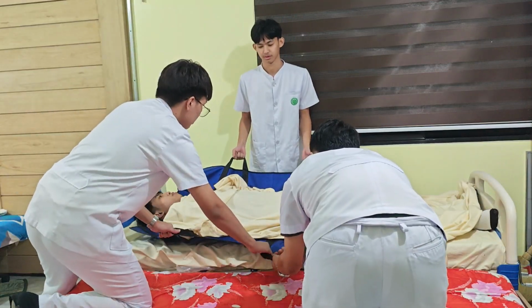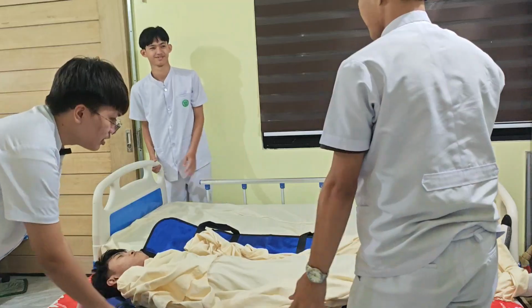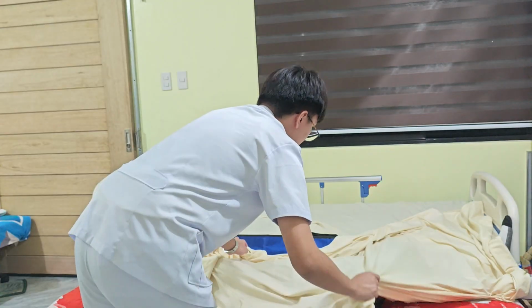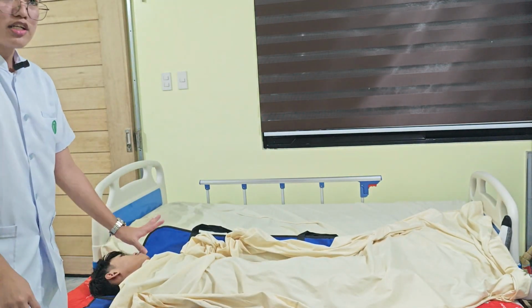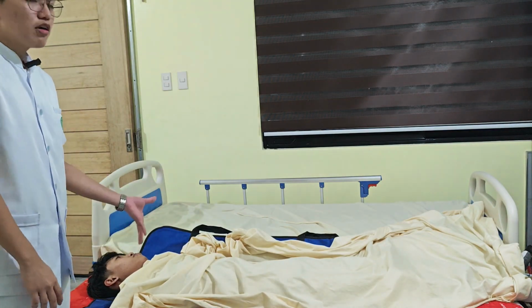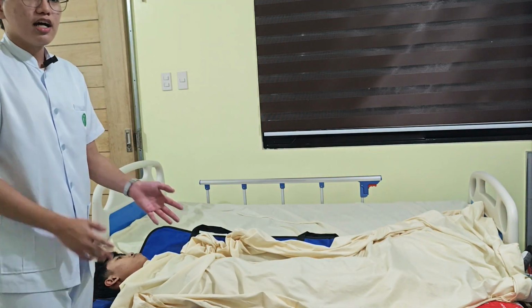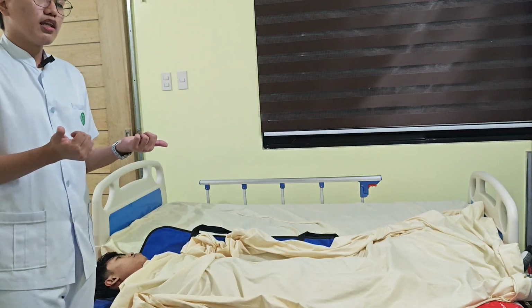So, 1, 2, 3. Next, after safely pulling the patient, we're going to check the patient's comfort as well as their blanket. Next, we're going to leave the friction reducing sheet on the patient for return transfer. Next, we're going to check and clean the patient's transfer aid as well as do hand hygiene, and we're done.